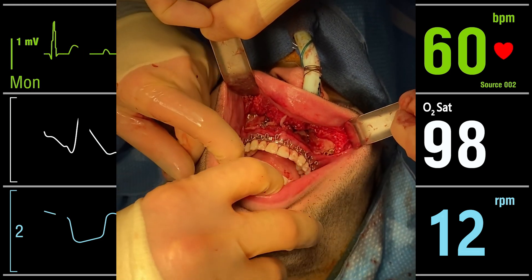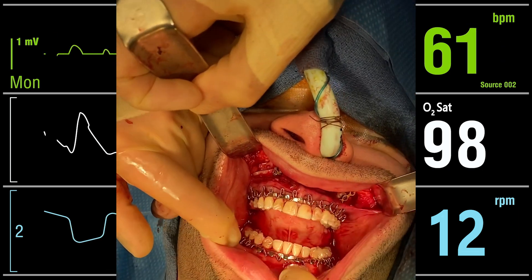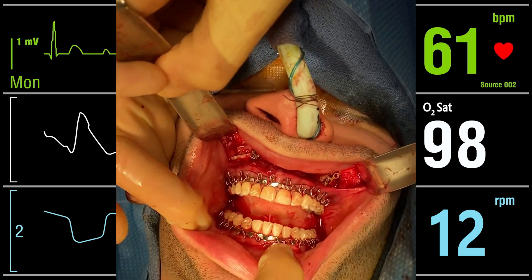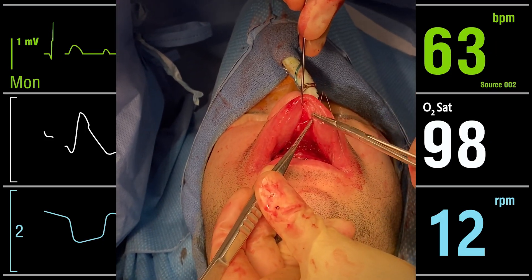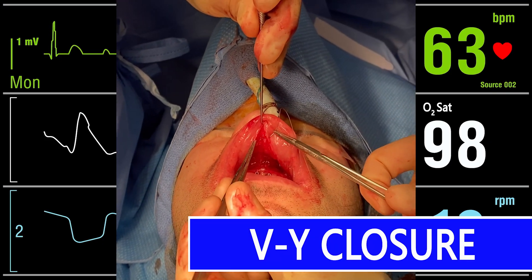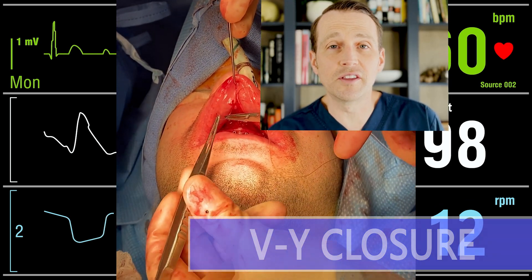I need to confirm that the occlusion is stable and the condyles are sitting in the fossa appropriately, so I take the patient out of interdental fixation and check the bite. I'm very happy with this new occlusion. I then irrigate everything thoroughly and close the soft tissue using a VY technique. This will help maintain the height and thickness of the upper lip.